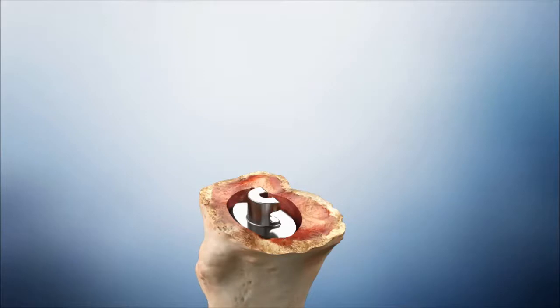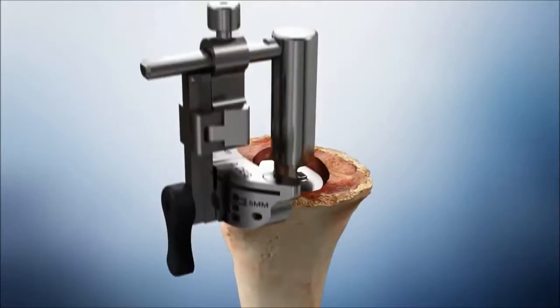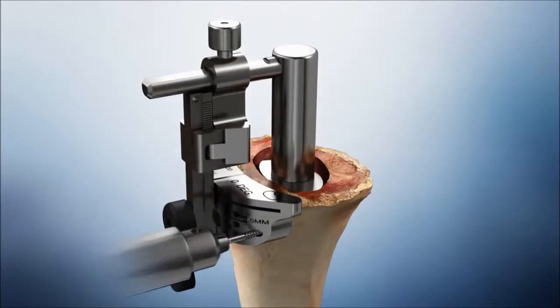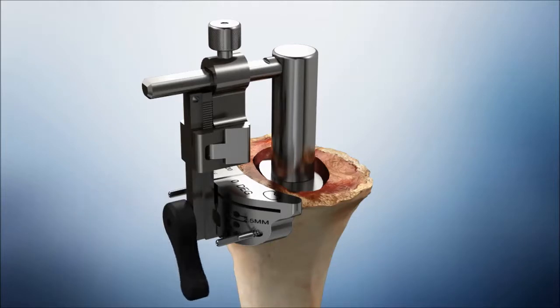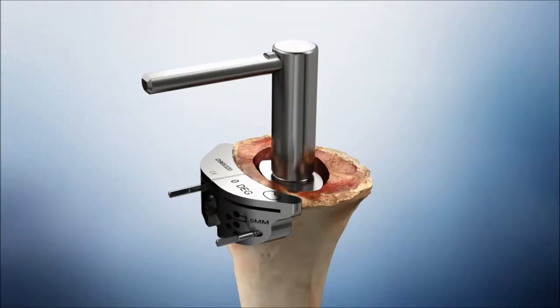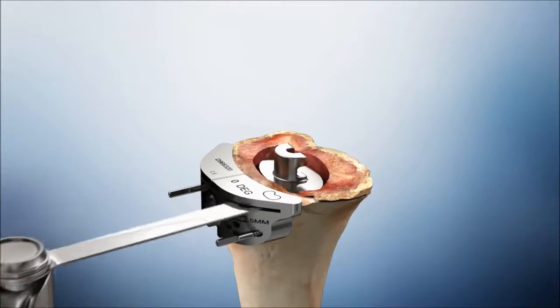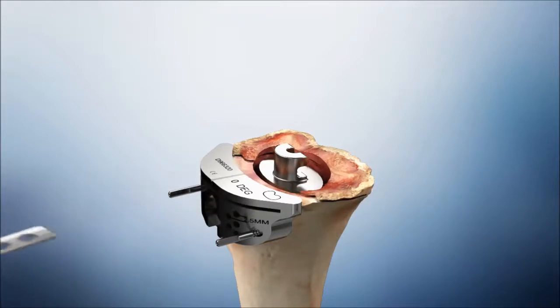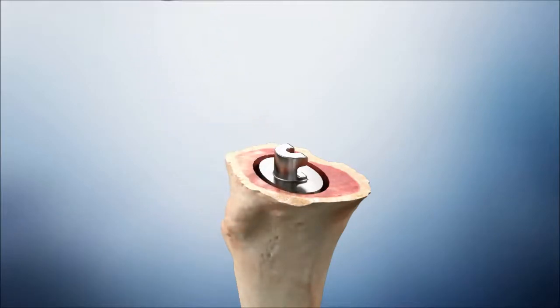The proximal resection may be made off of the broach, or assemble the MBT tibial broach adapter with the IM tibial referencing device and 0-degree tibial cutting block and attach to the broach. Pin the cutting block. Remove the IM referencing device and the tibial broach adapter. Resect the proximal tibia. Remove the pins and remove the cutting block.